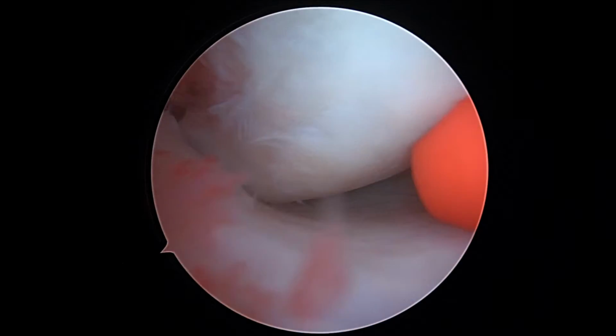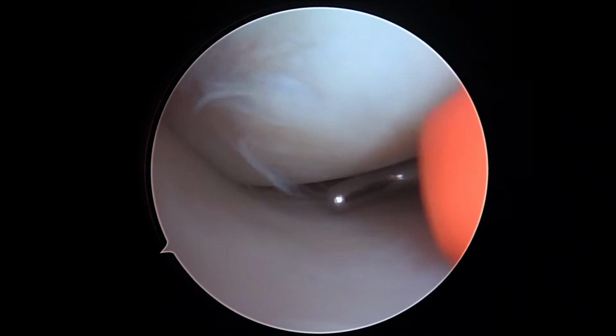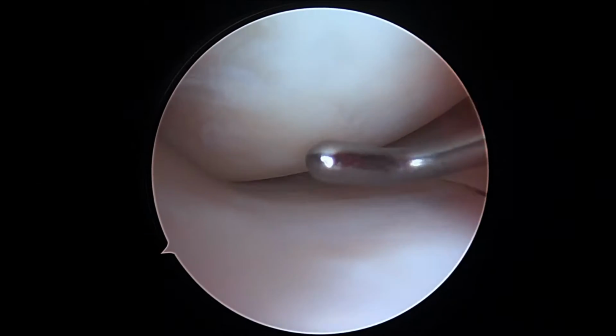Okay, it's Dr. Buford. We're just getting started on the right knee. We're looking in the medial compartment first. We'll show you what that looks like here. There's our cannula on the medial side coming in. We're going to back it up a little bit so you can see the probe coming through it.